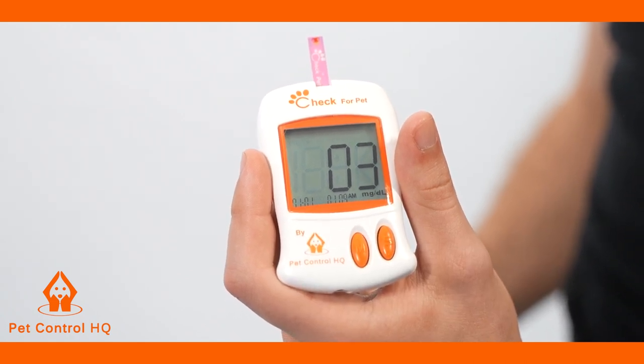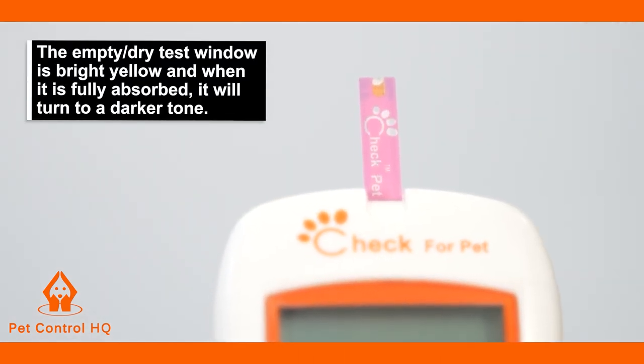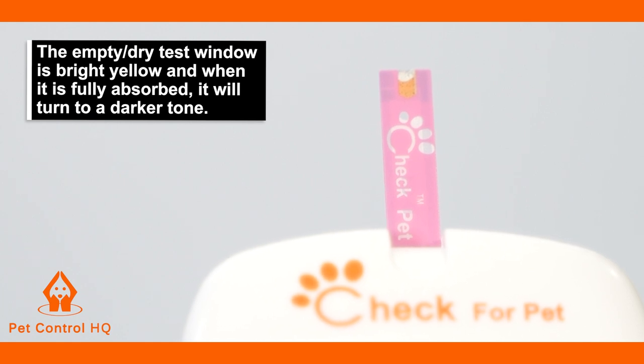Please do not remove the test strip before the test window is full. The empty or dry test window is bright yellow, and when it is fully absorbed it will turn to a darker tone.